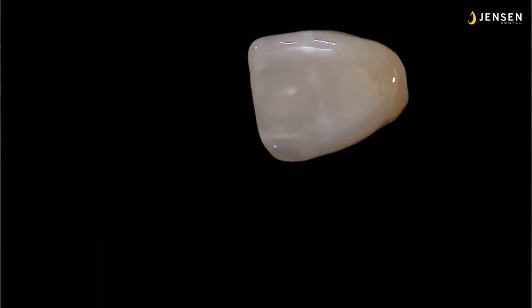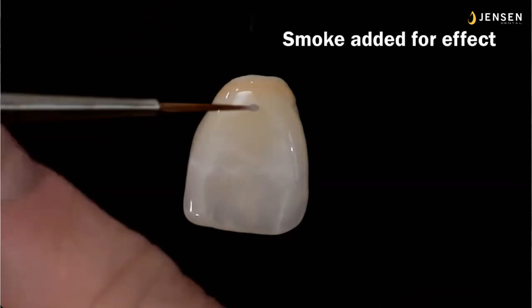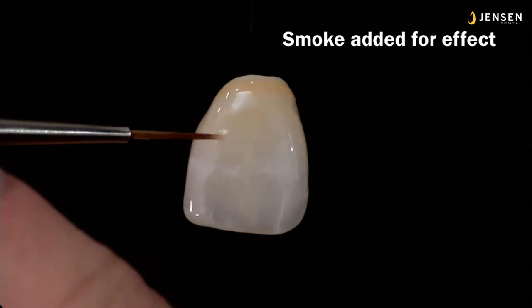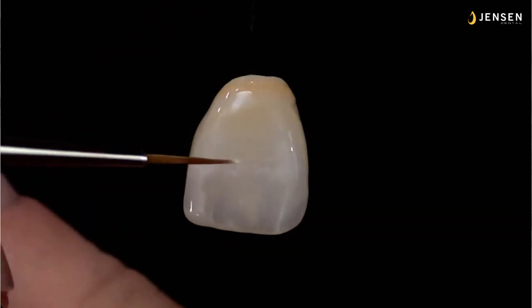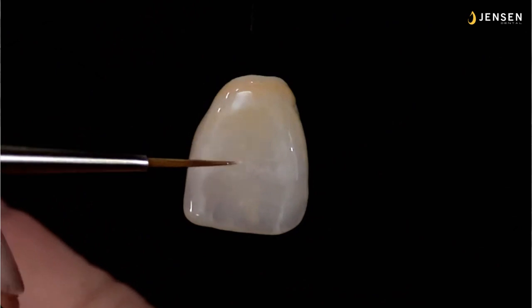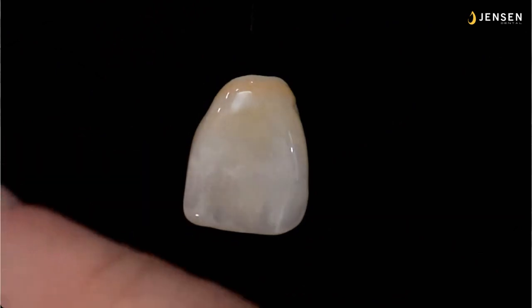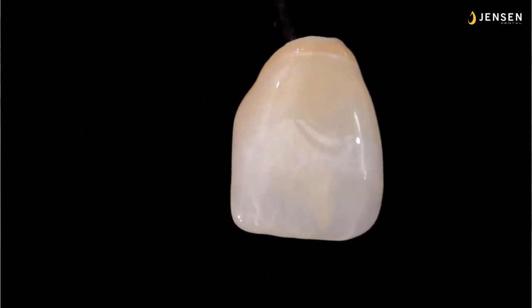I put it on in lines, and then I'll feather it and push it back and forth so you have kind of like clouds in the middle. And now I'll add a little bit of smoke, just like we did to the mamelons, to have it contrasted against the storm. I'll use a little bit of smoke above the hypocalcification, and that'll lower the value against the white. It just gives it a little bit of a pop. Without making it dramatic, you don't know what's going on, but it looks nice.